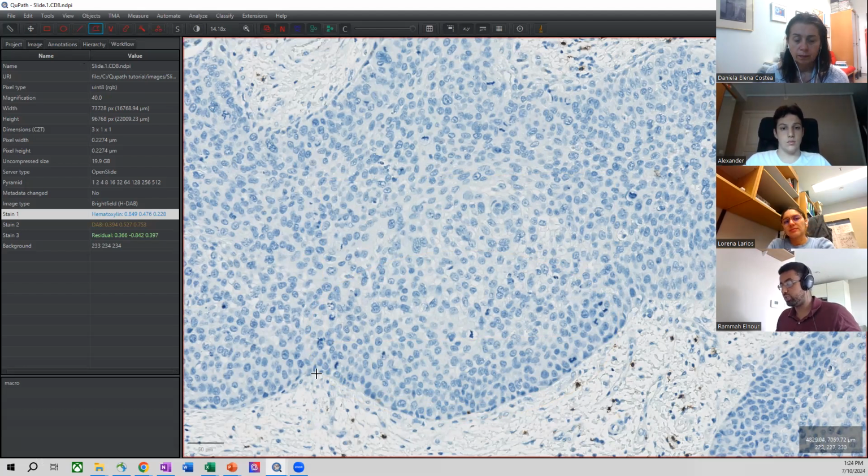So here you essentially click around the outskirts of the annotation that you're interested in. So I can, for example, click here, click there, and so on. Click my way throughout the entire annotation. And this could theoretically work, but I don't find it to be the easiest way of doing this. So I'm just going to delete that annotation as well.